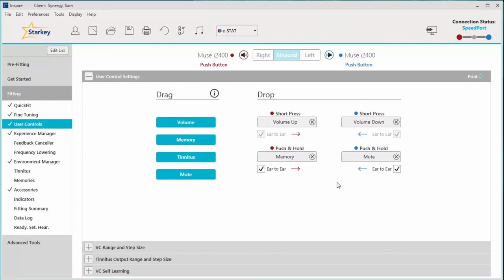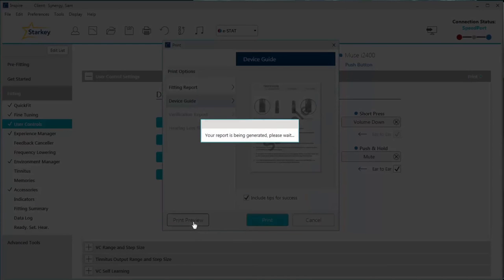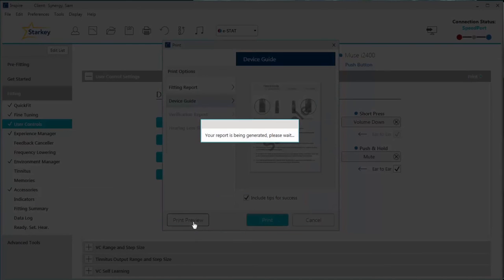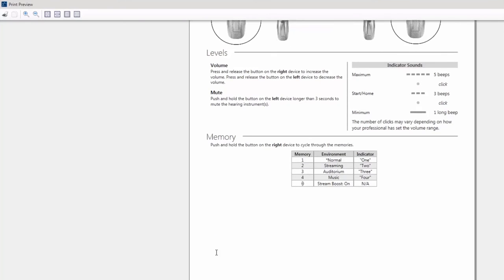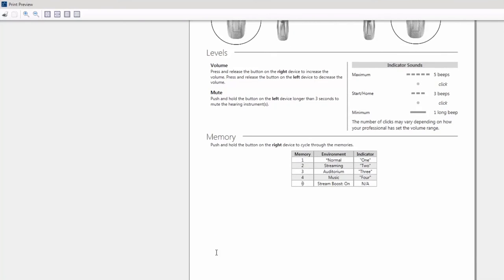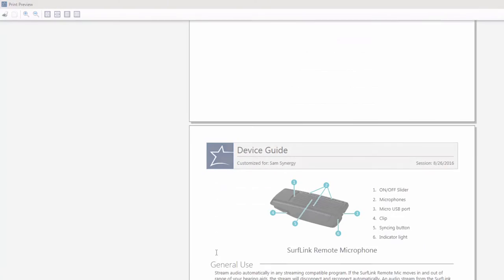The last thing I'd like to show you on the user control screen is how to print the patient device guide. Click on the print button at the top right of the screen. The patient device guide is a great tool to give your patients at the first fit or anytime you activate the user controls. It's a personalized report that explains exactly how the patient's user controls work as well as what memories or accessories have been enabled during the fitting.